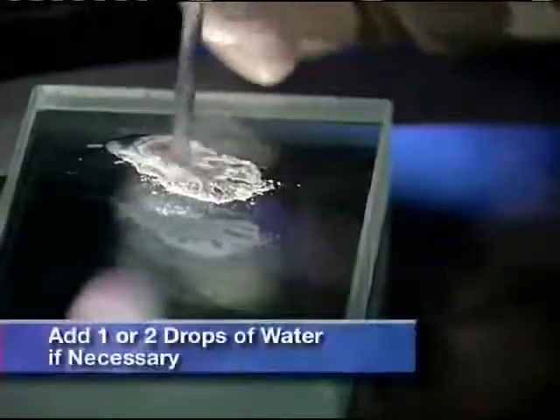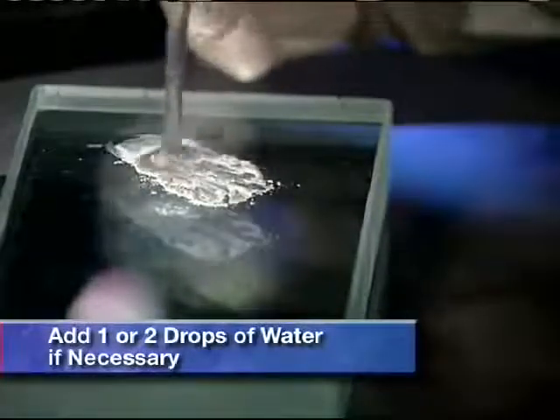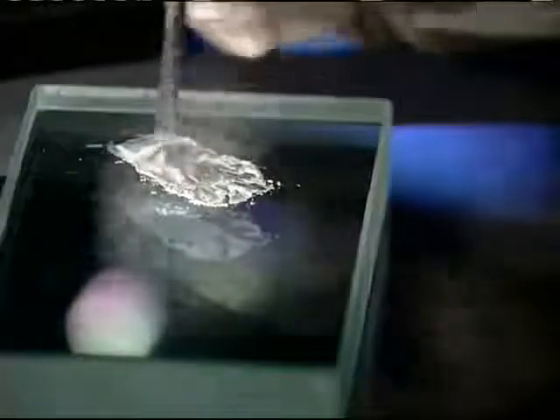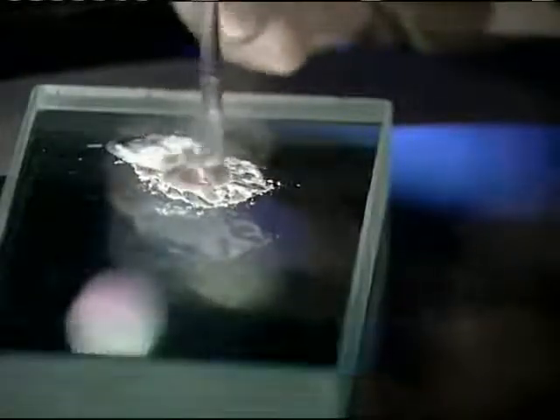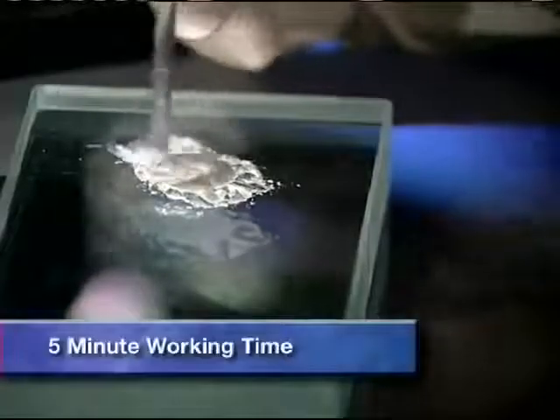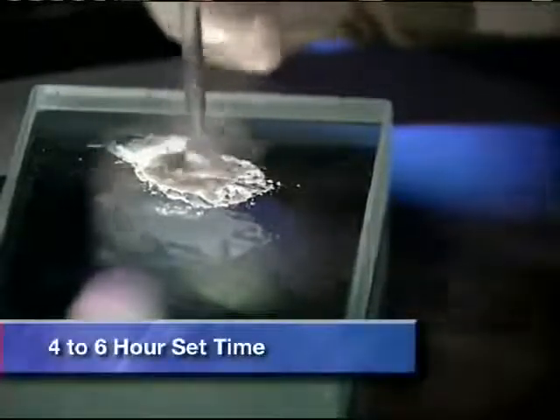If you find the ProRoot MTA mixture is too viscous or stiff, one or two drops of sterile water may be added. The mixture should be a thick, creamy consistency. The working time is about five minutes and the material will set gradually over a four to six hour period.